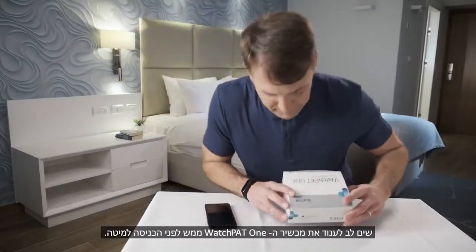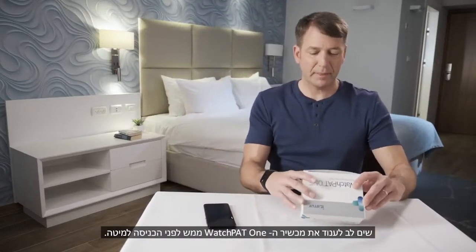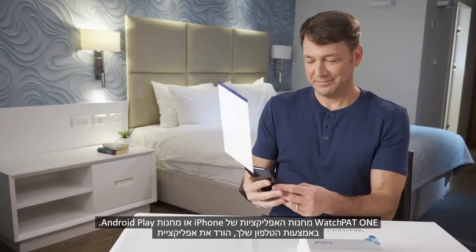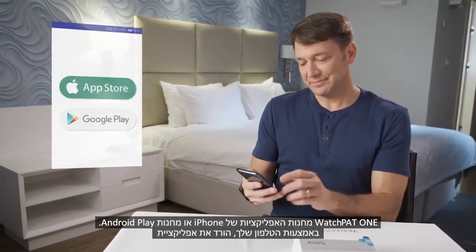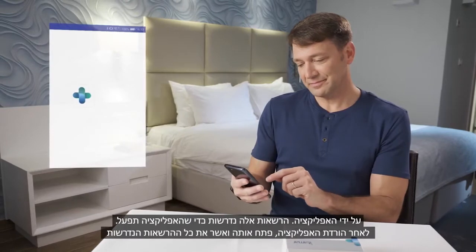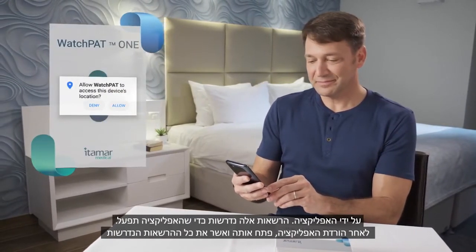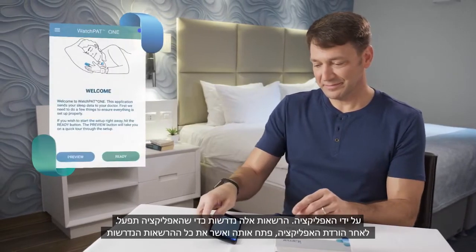Please note that you will put the WatchPat 1 on just before getting into bed. Using your phone, upload the WatchPat 1 app from either the iPhone App Store or the Android Play Store. After downloading the app, open it and accept all permissions required by the app. These permissions are required for the app to operate.